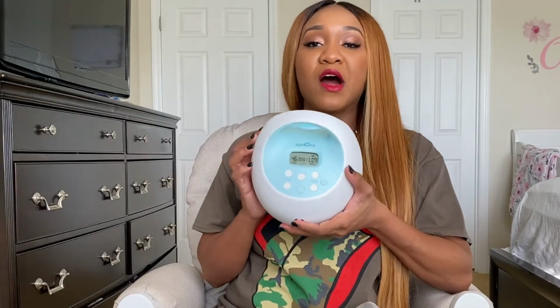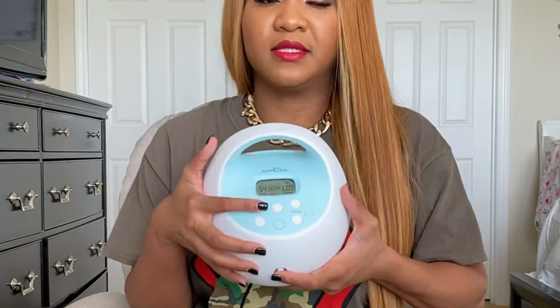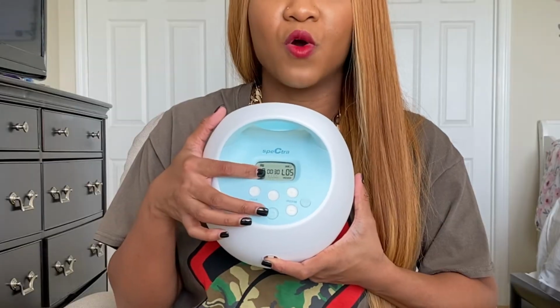When you press power, it's gonna automatically go to your letdown mode, right? And you have different cycles. You have cycle 38, 42, 46, 50, and 54. When you first press it, you're gonna wanna press this little button right here so that you can go to massage mode.